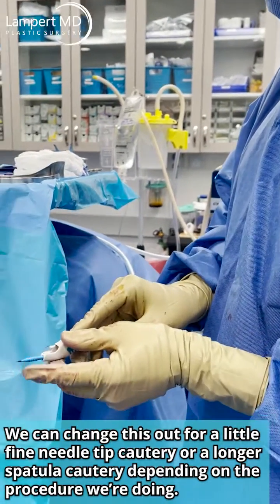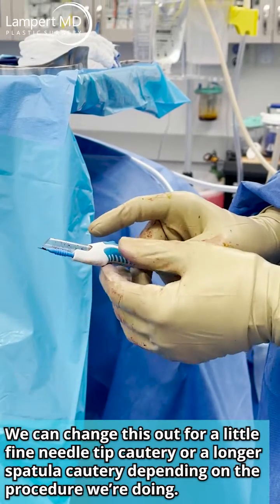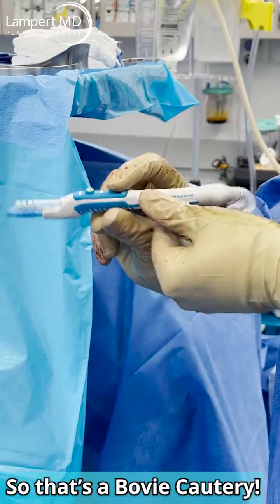We can change it out for a little fine needle tip cautery, a big longer spatula cautery, or whatever we want, depending on the procedure we're doing. So that's a Bovie cautery.